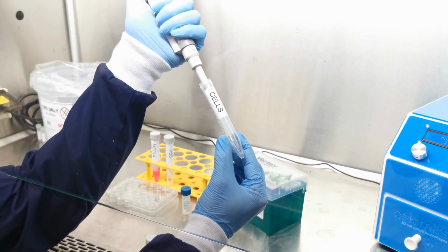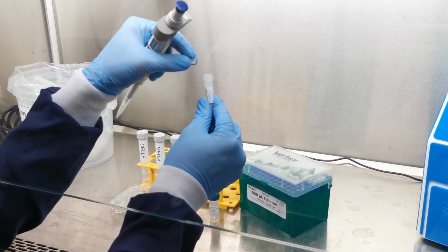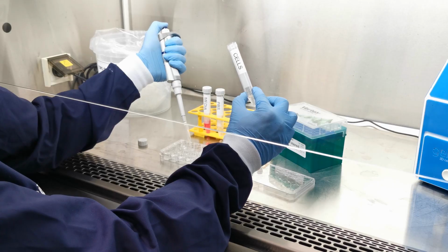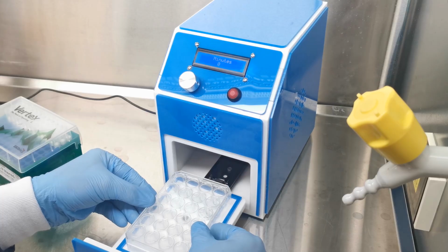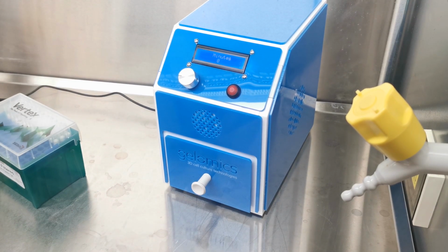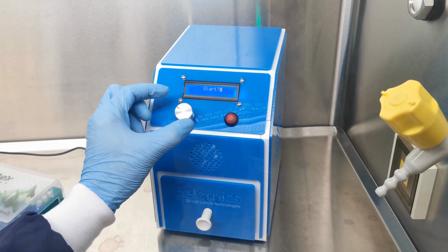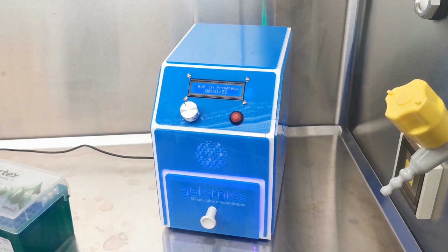The cell-laden hydrogel mix is then dispensed into the desired microwell plate, typically 24 or 96 well. The plate is then placed within the Luna crosslinker where photopolymerization with 405 nanometer visible light takes place. Now this is where I can directly control the ECM stiffness. For example, if I want to study healthy breast tissue, I would cross-link for a much shorter period. Equally, I could set up diseased models side by side by cross-linking for an extended period with a stiffer ECM.